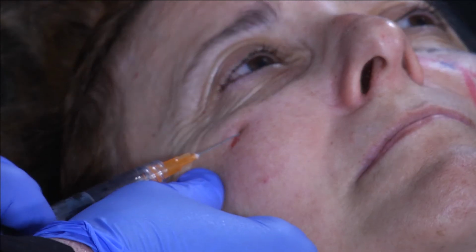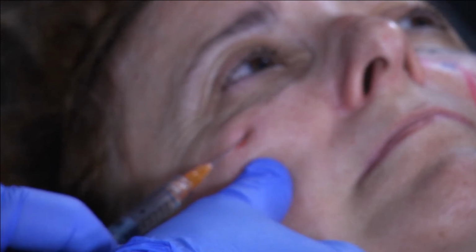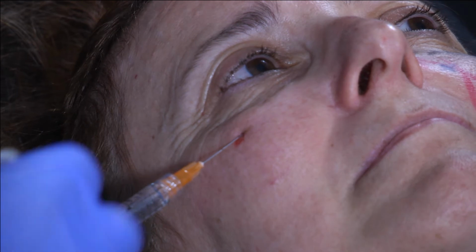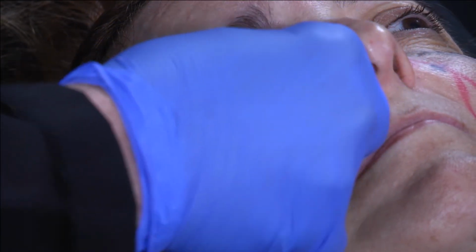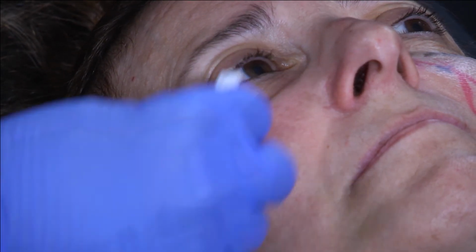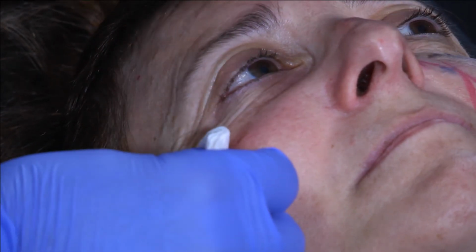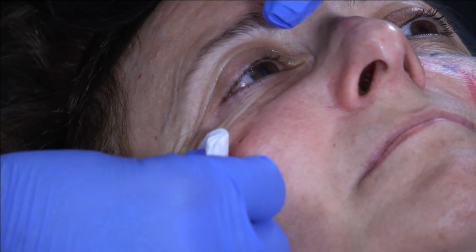So on one side, as you can see here, I will inject this patient less than 0.5. Then I have finished. I just make a swab like that, just to erase the product, but I do no massage. Why? It's because I put my product on the bone.